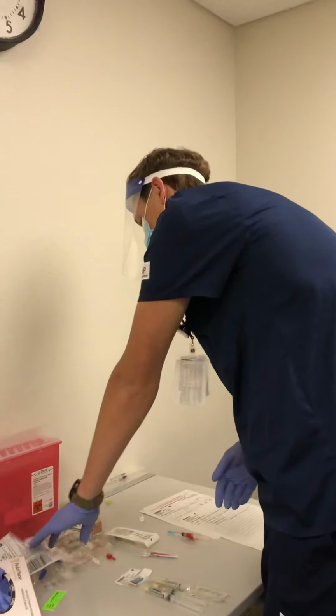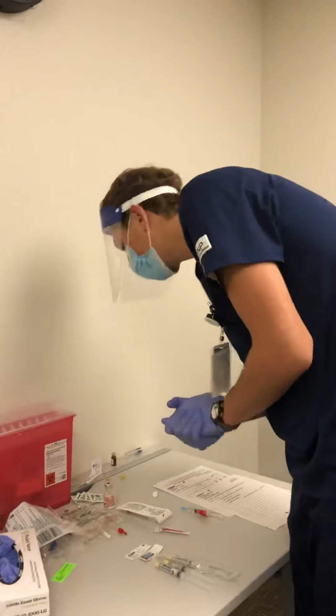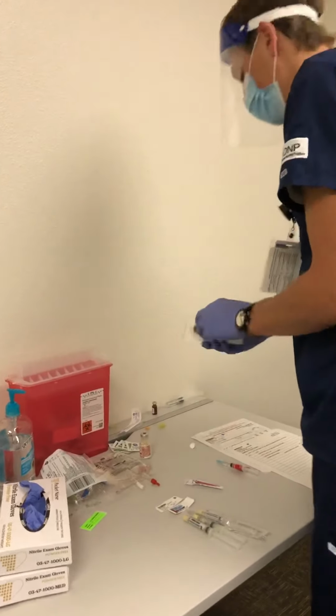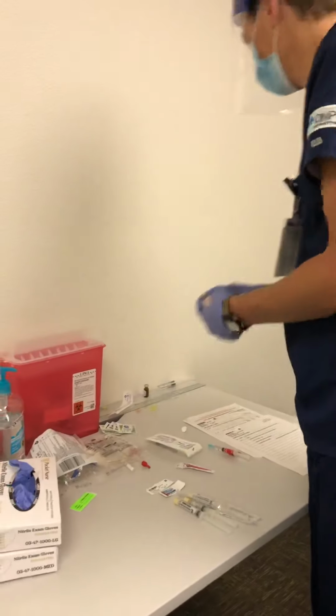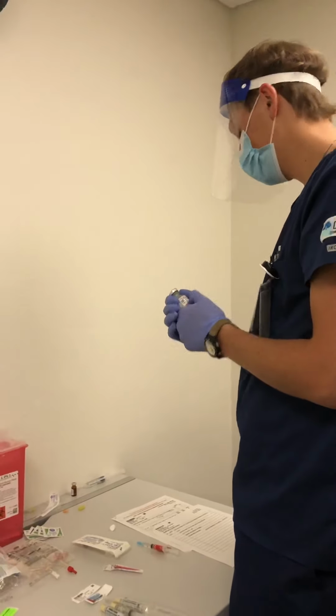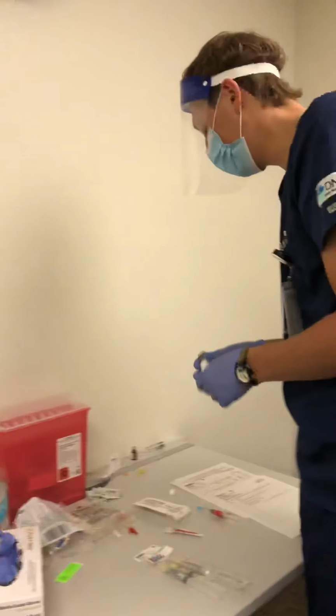With that, I am also going to need my IV tubing and an IV tubing label, and I have my labels here for my medication when I get it pulled. So here I have my potassium chloride, and it is at 2 milliequivalents per milliliter, and through my dimensional analysis I know that I'll need to pull 10 mL out of here.